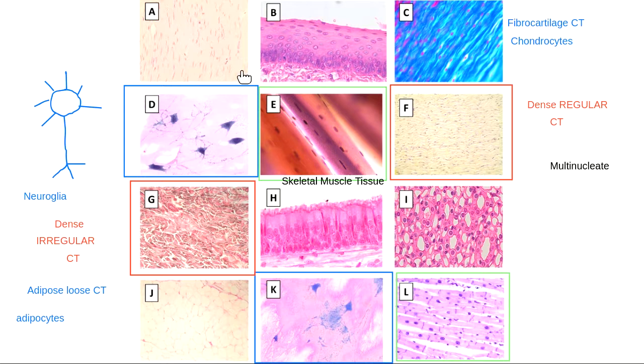This one up here we've kind of seen before, we talked about before. What type of tissue was A? Tissue type A. We just looked at this one. Yep, A up here is another type of muscle. So it's my smooth muscle tissue up here. Let's add that name, smooth muscle. Smooth muscle up top.